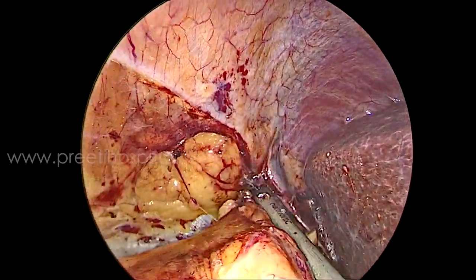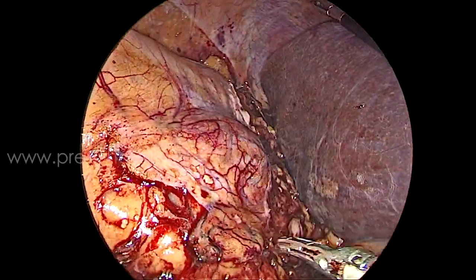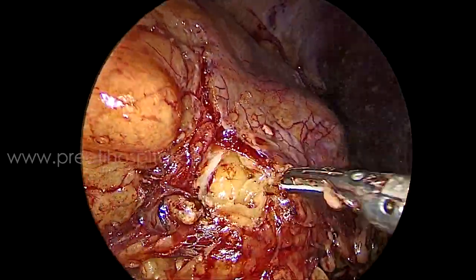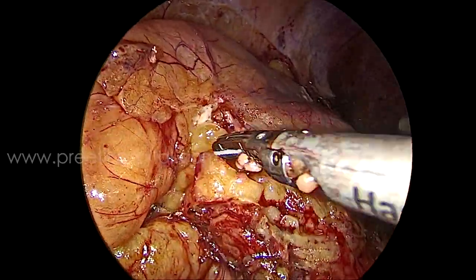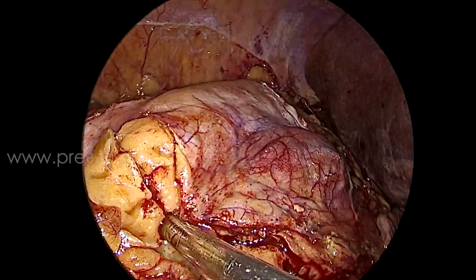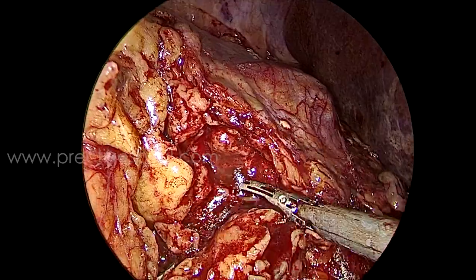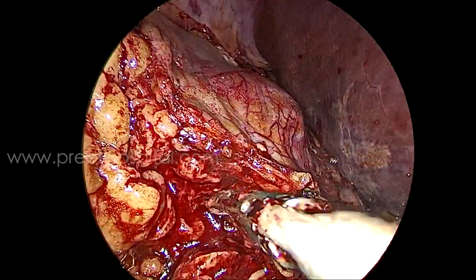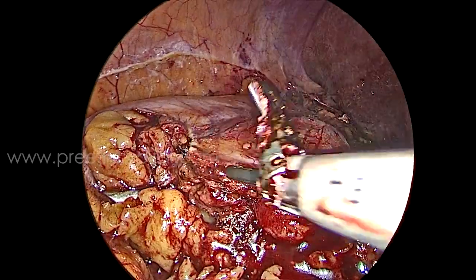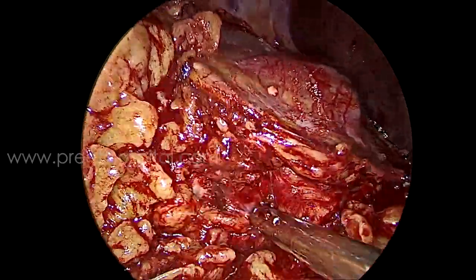Now the main reason for sharing this video: we don't know where the tumor is. This is where the role of ultrasound comes in — unfortunately it was not available. When you are cutting through the toxic fat you don't know the depth. If you open the capsule, continuous ooze will come. Here the capsule is not seen — only dense fat. Suction, cautery, harmonic, and scissor were all used.